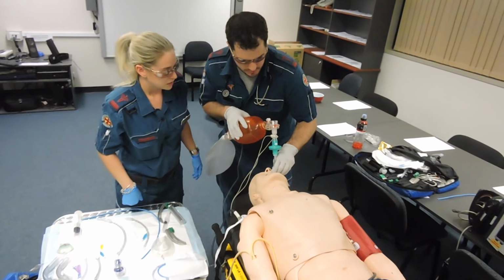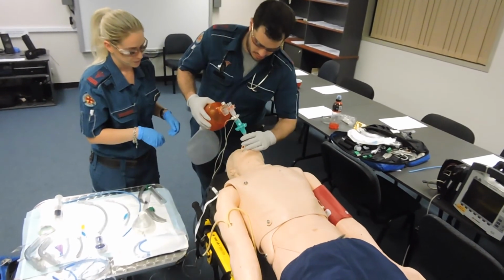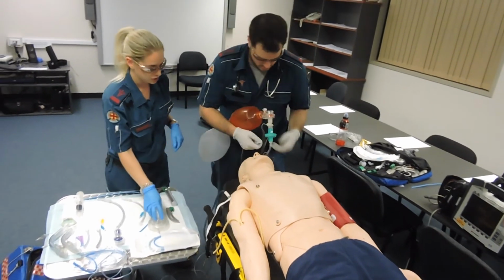Rach, I'm not getting any rise and fall. No, we've got no CO2 waves, so let's take that tube out. Okay. We've got a failed intubation, guys. Then take that tube out.